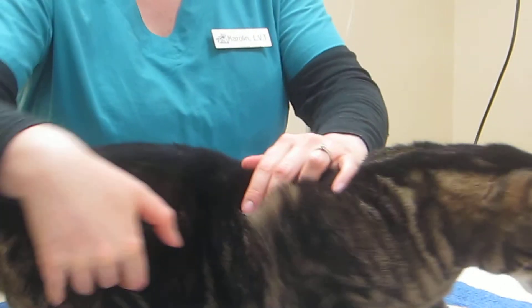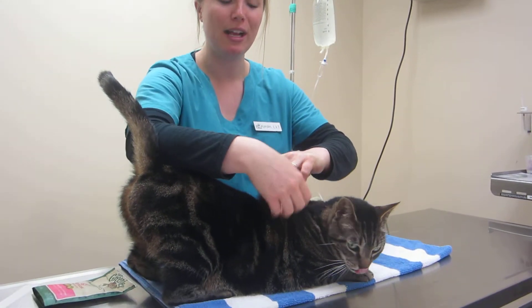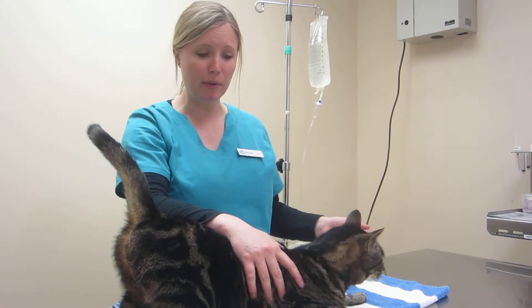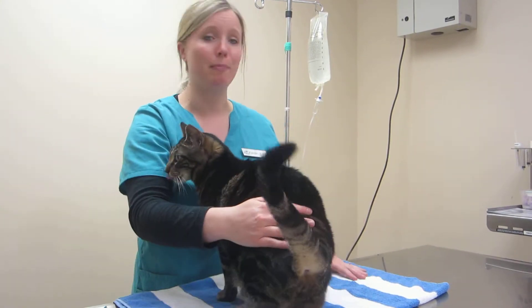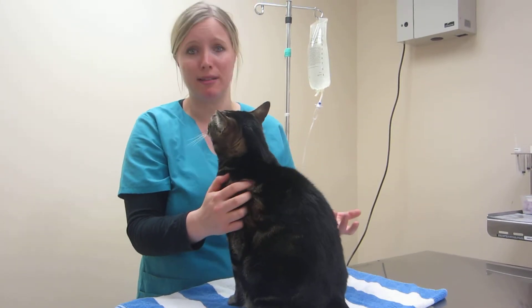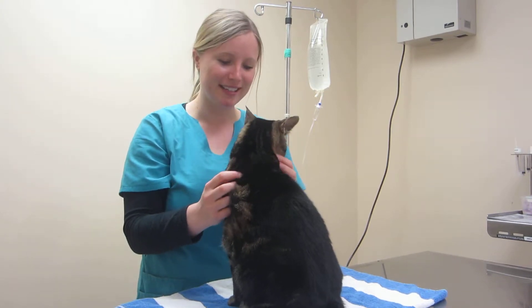There are two things that can happen. You can go through the other side of the tent, right here, and you're going to have some leakage. If that happens, you just close your clamp, pull out, and you're going to start over. It's really not that bad — it's just messy. It's something that happens even to us sometimes, so just don't panic. Your cats — or your dogs — can tell when you're getting stressed.